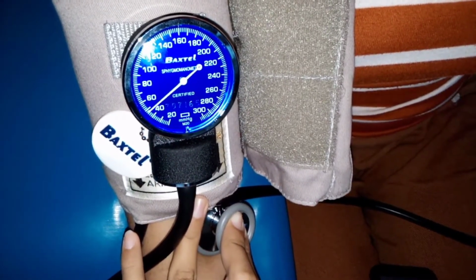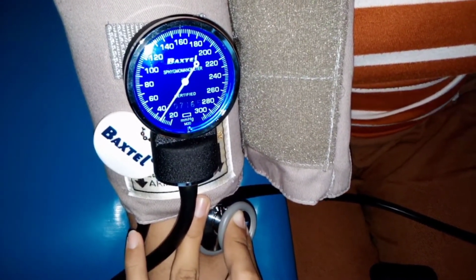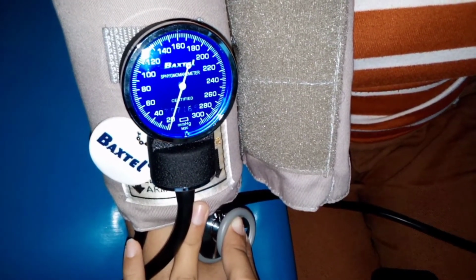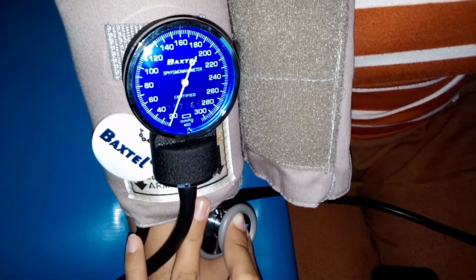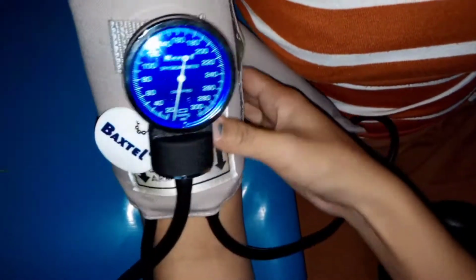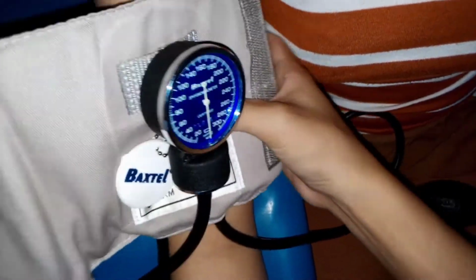The blood pressure of my patient is 110/70, and that is normal. The normal blood pressure is 120/80 millimeters of mercury. After that, let's remove the cuff and remember to deflate it completely.